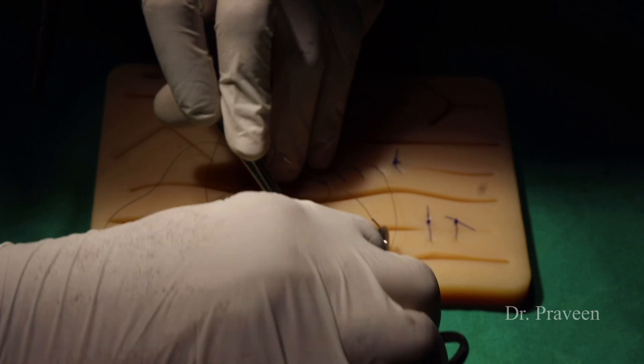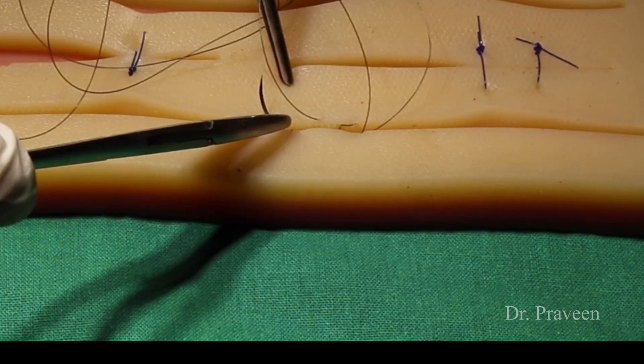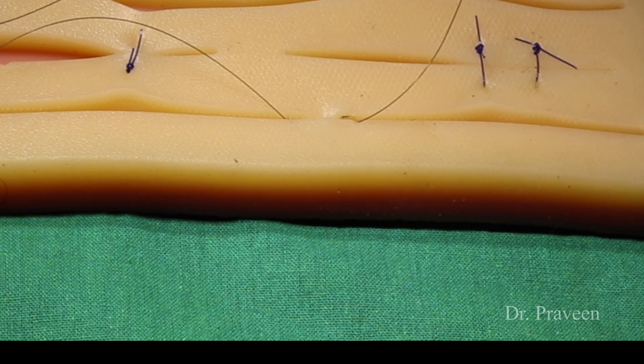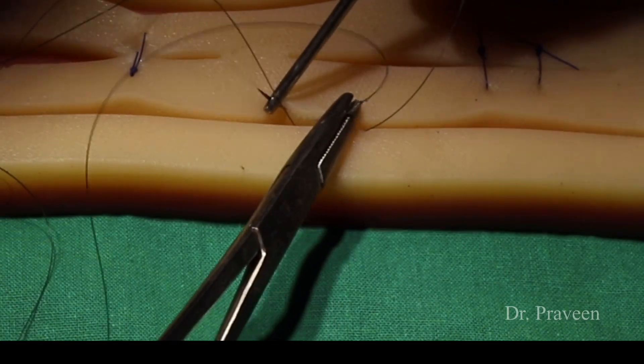The needle has to be passed in the dermal layer of the skin for the subcuticular technique.